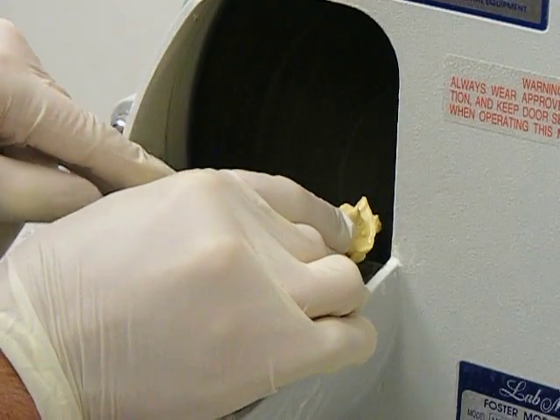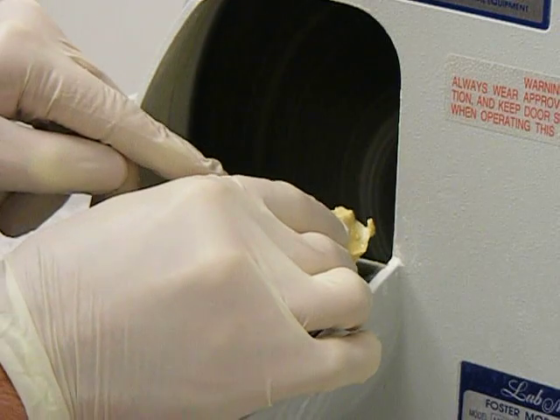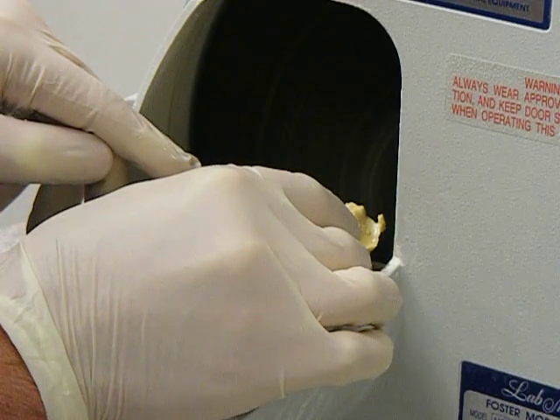Trimming the heels first — apply even pressure on both sides, not favoring one side or the other, and place it against the grinding wheel, making sure that it's stable at all times.